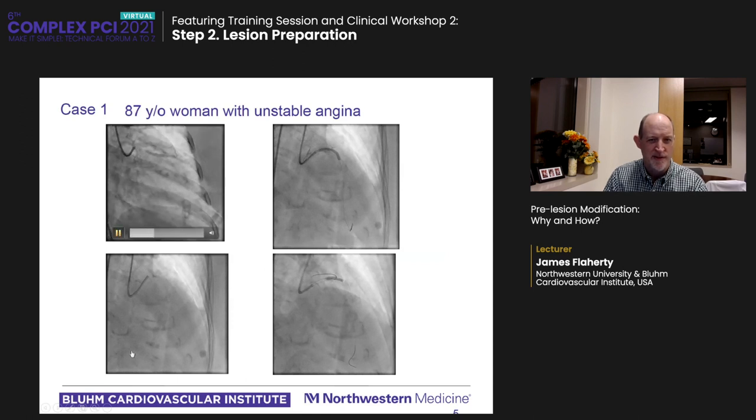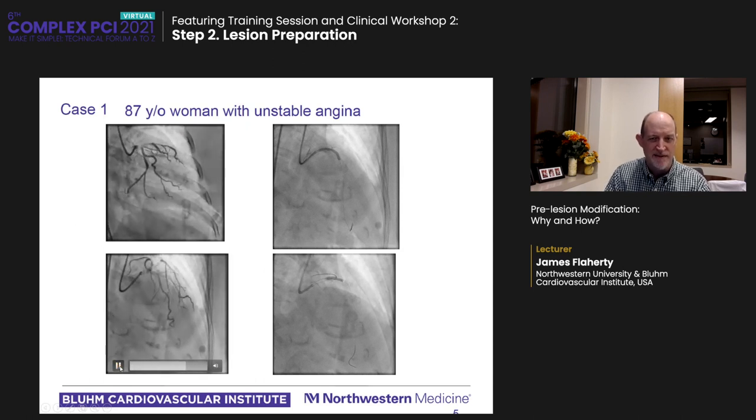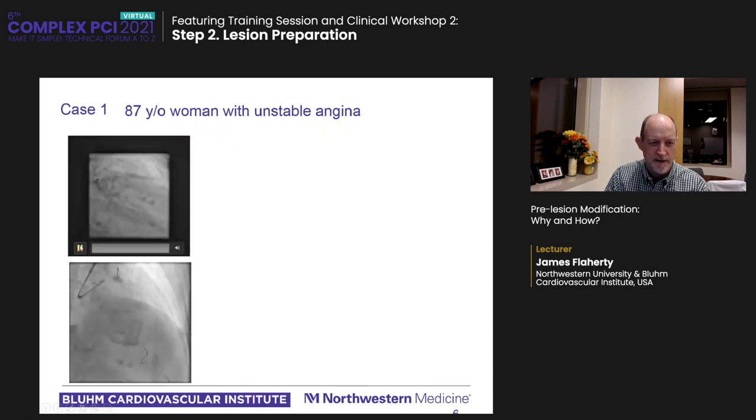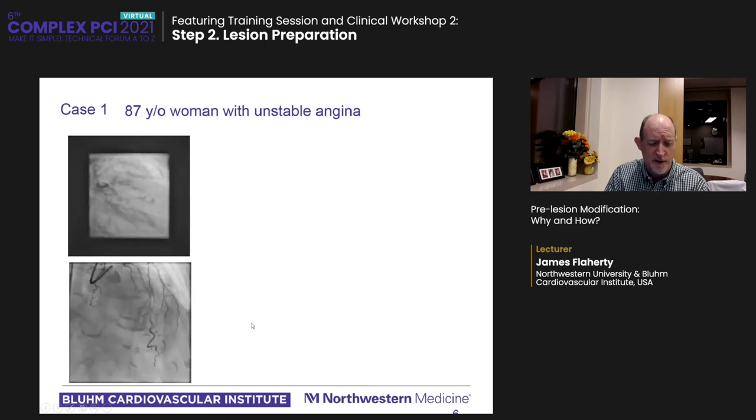An 87-year-old woman with unstable angina, severe calcified lesion in the distal main into the LAD. Here's a stent that looks like it's expanding okay. Here's a post-dilation balloon, looks to be well expanded. And on this view, it looks like a nice angiographic result. On this view, it's a little harder to lay out. So what do you do?